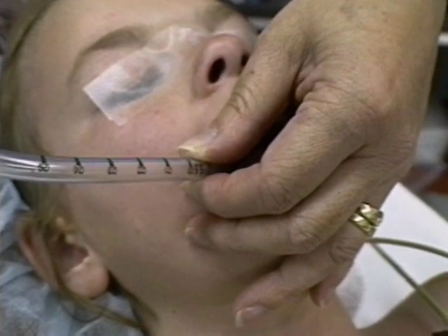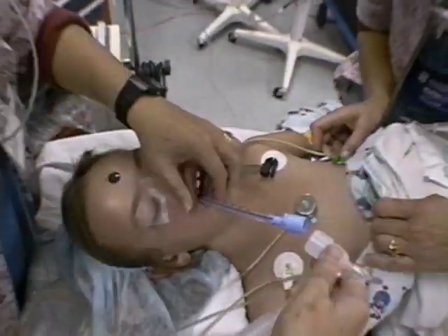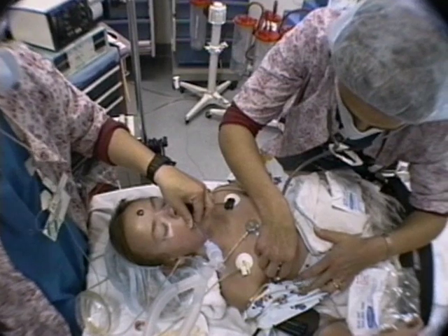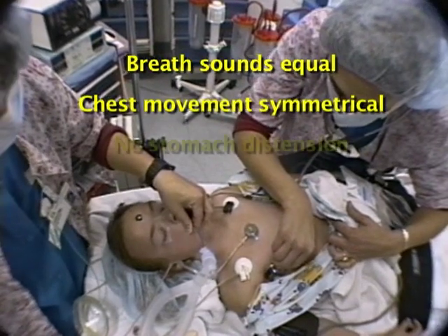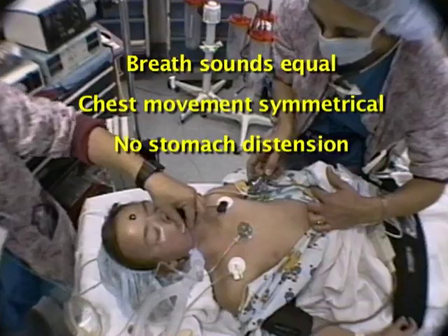Never assume the tube is in the trachea. Verify tracheal placement by listening over both axillae and the stomach. Easy transmission of sound makes esophageal intubation harder to detect in a child. Breath sounds should be equal and chest movement symmetrical. Stomach distension may indicate an esophageal intubation.